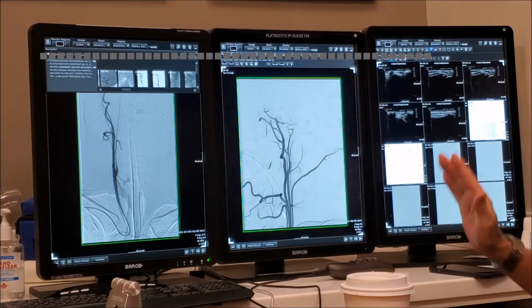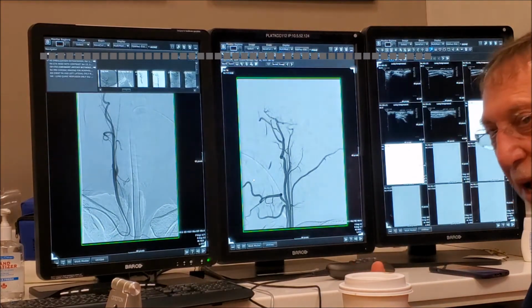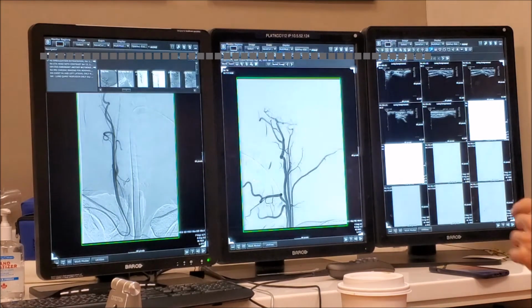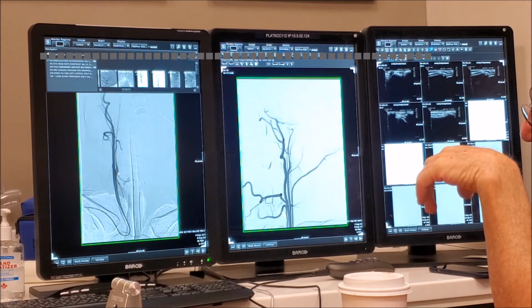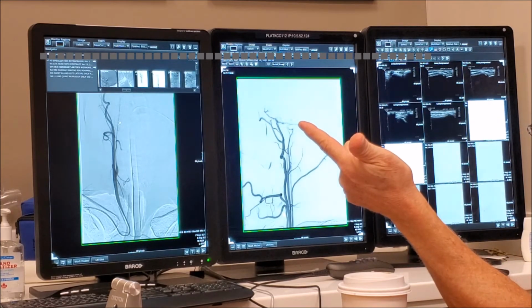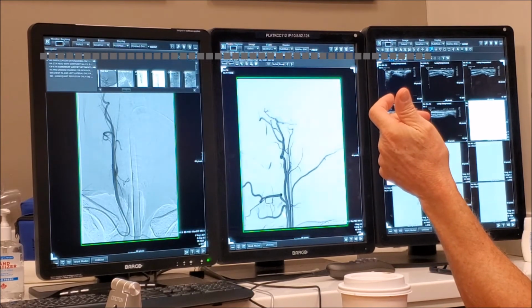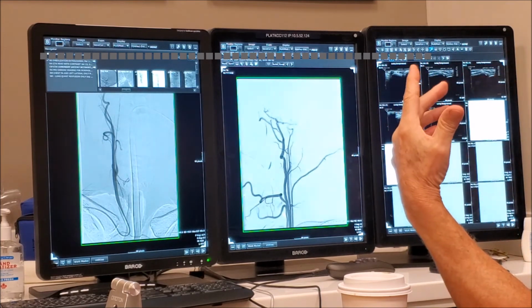Wait. No. There's an internal carotid, there's an external carotid artery. Now the external carotid artery must be supplying the whole brain because they are through both. But it's not. So I need to get that one. There's a new one on me. Physiologically, anatomy. No, something happened here. Okay? There is a vessel that was a little bit larger, then becomes a teeny weeny thing. The question is now, this one, is it a dissection? Is this the ascending pharyngeal artery? Okay? Is this the so-called stapedial artery? And then we come into this one, and again, when you're faced with something like that, you go backwards, okay?